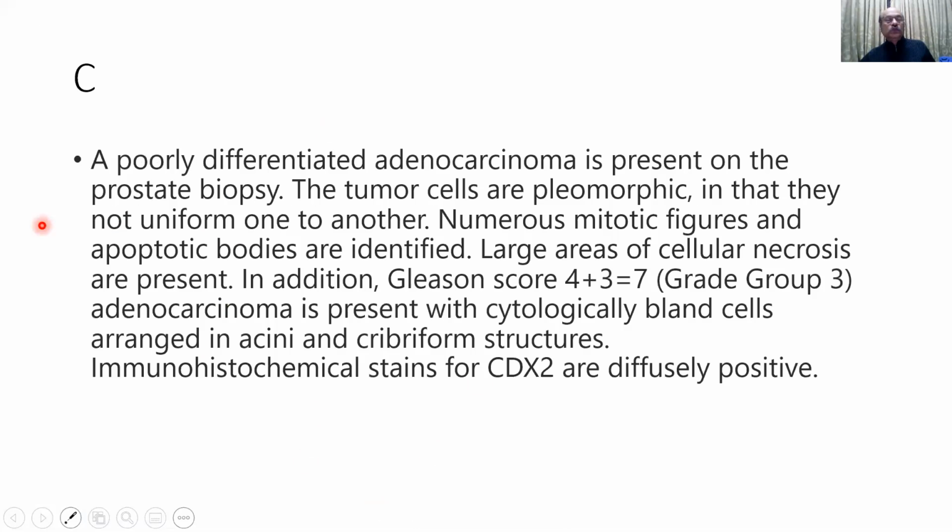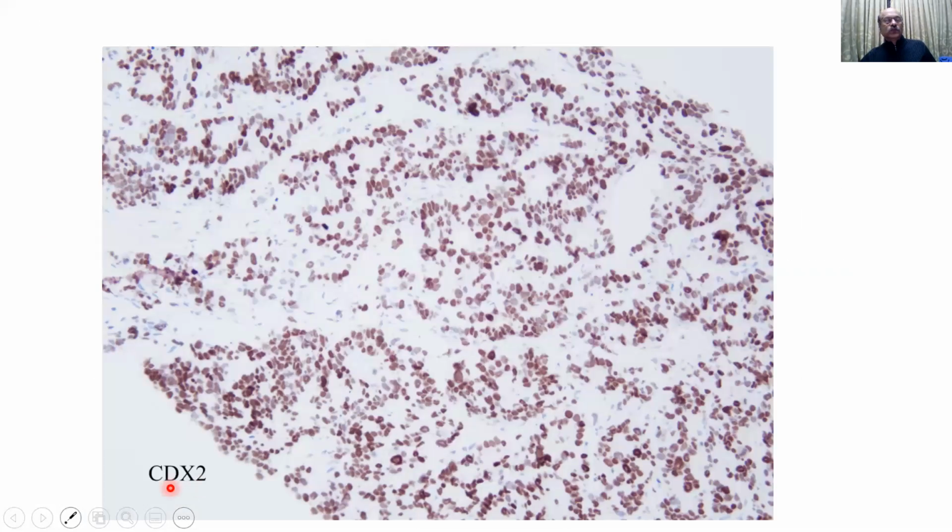So it is a poorly differentiated adenocarcinoma, and the tumor cells are pleomorphic, not uniform. This tumor shows CDX2 positivity.